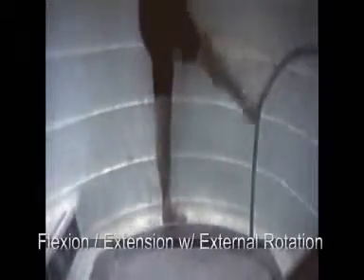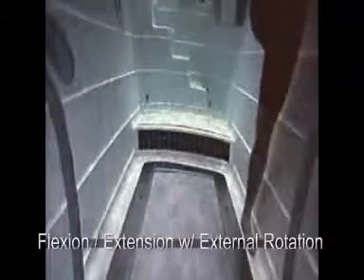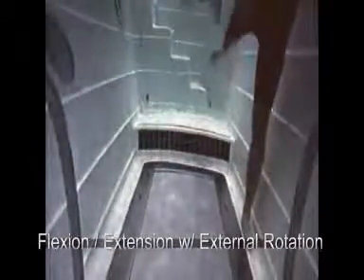So we're doing flexion extension, and here's flexion extension with a little bit of external rotation of the hip. There again, I'm focusing more so on the groin type of injuries, very hockey specific, making sure the adductors and abductors are working together. But right now, just trying to keep a normal plane of movement.